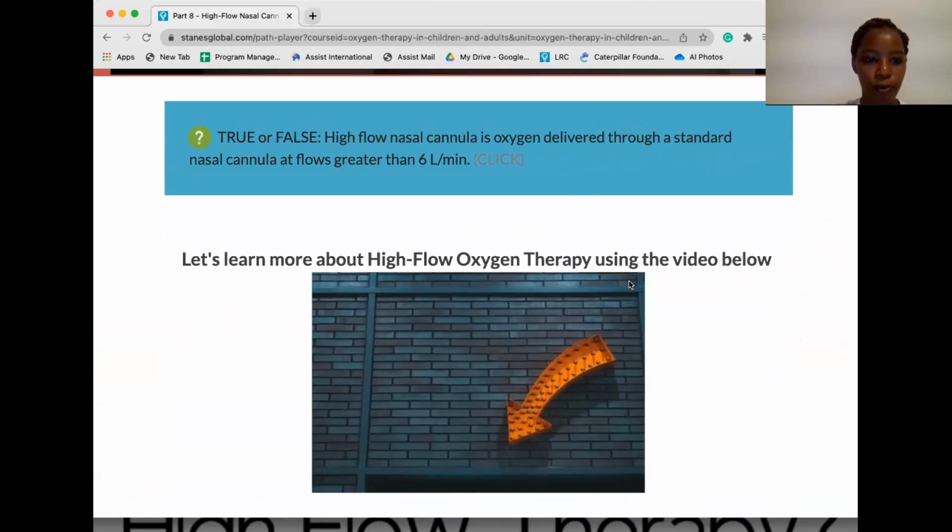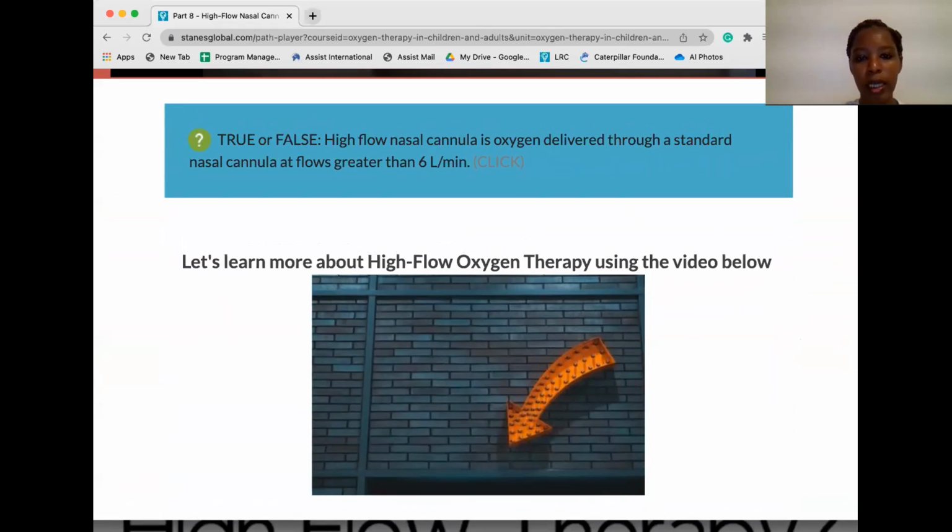So a question, true or false? High flow nasal cannula is oxygen delivered through a standard nasal cannula at a flow greater than 6 liters per minute. What do you think? Is that true or false? Kindly put your answers in the chat box. Is that true or false? Thank you, Dr. Mohammed. I can see false. Okay, so this is a false statement.